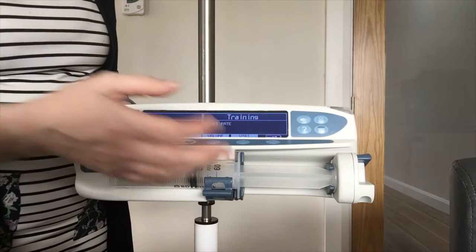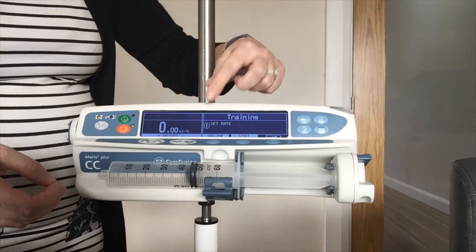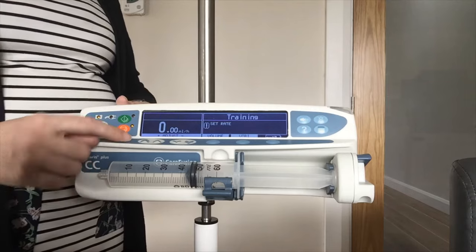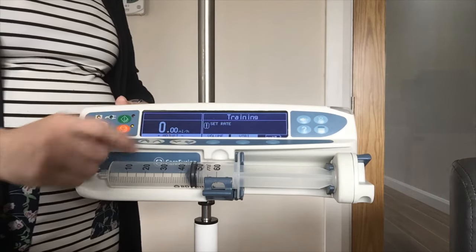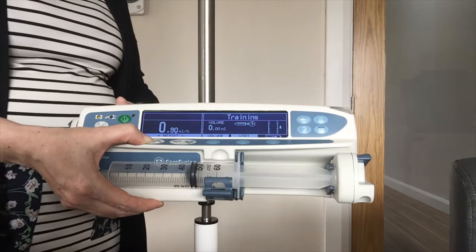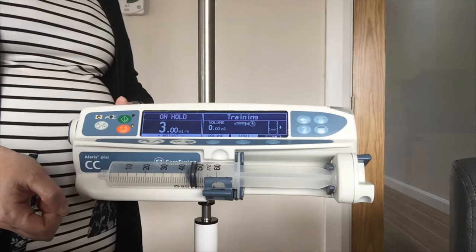On the screen now it is telling me that I need to set my rate. My rate is set in this section of the pump with the arrows underneath. I have got a double arrow going up and a single, and a double arrow going down and a single. The double arrow is quicker — if you keep your finger down it goes in increments of 0.1 for the first ml and after that will fly up. So that is my rate of 3.